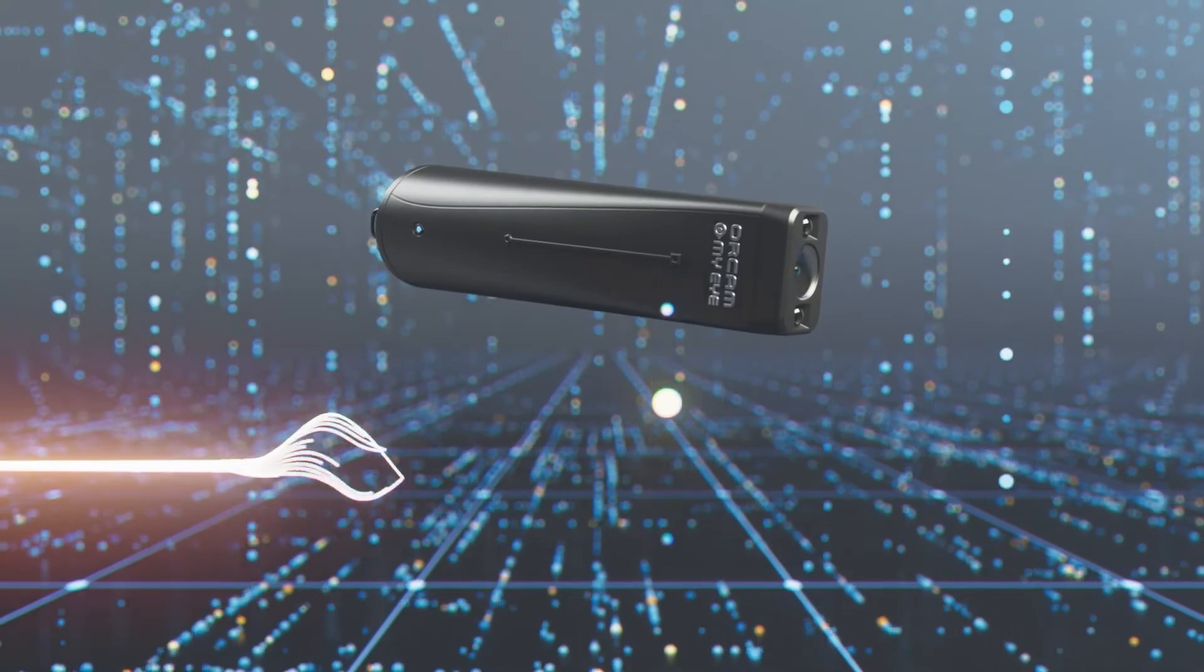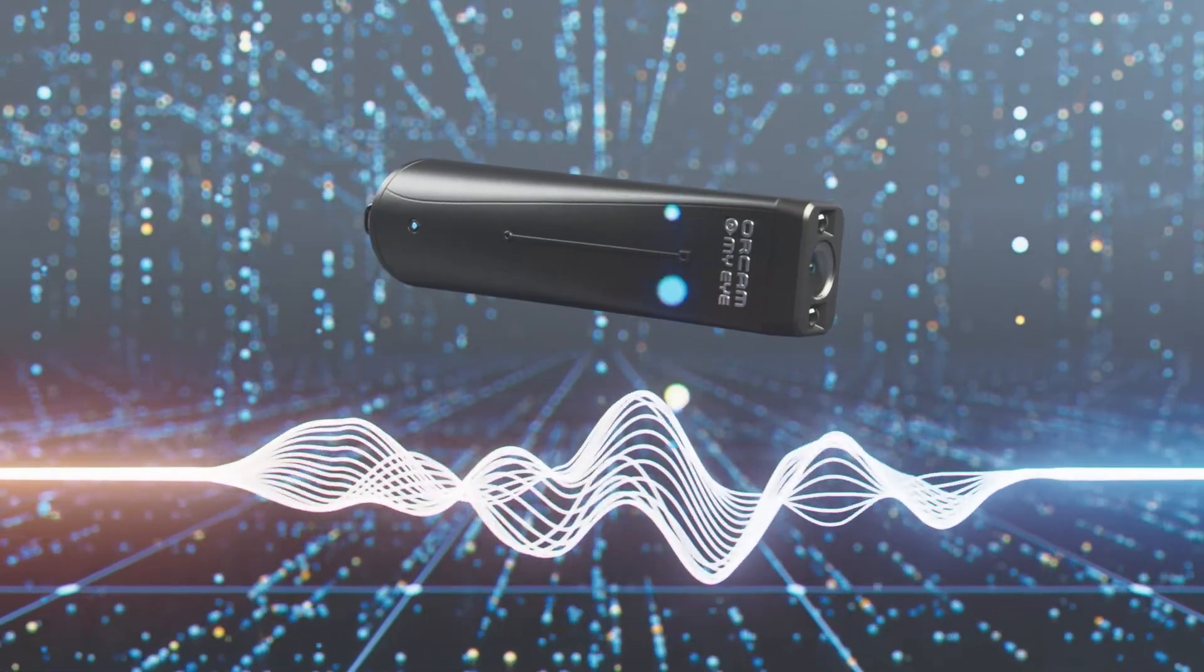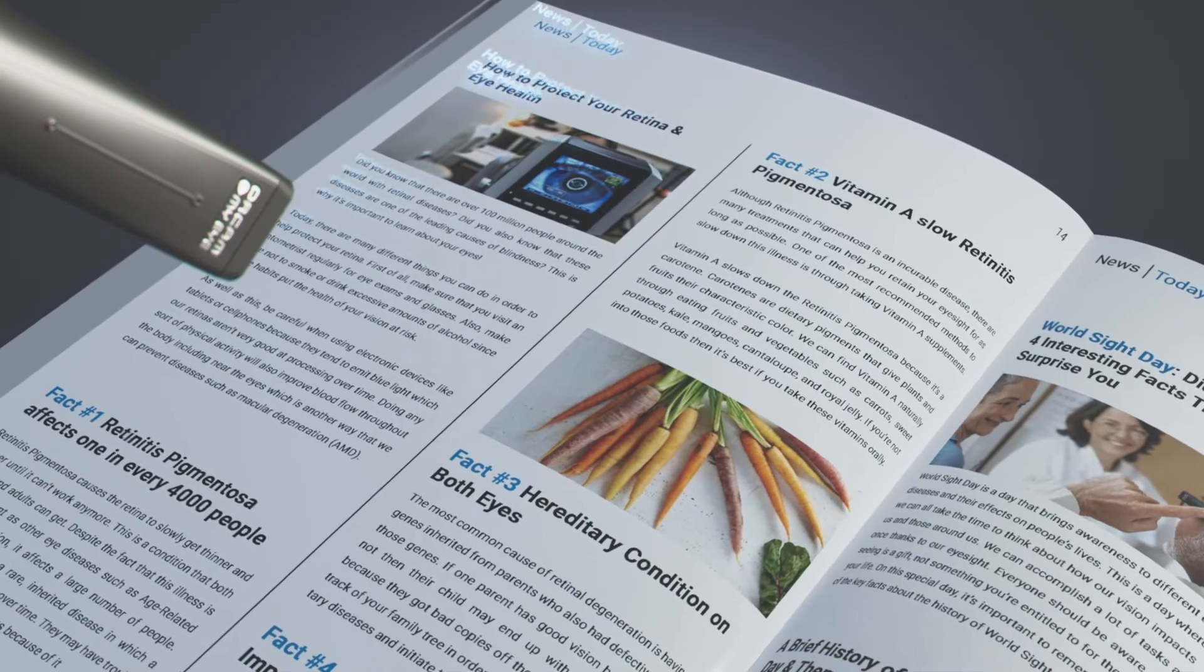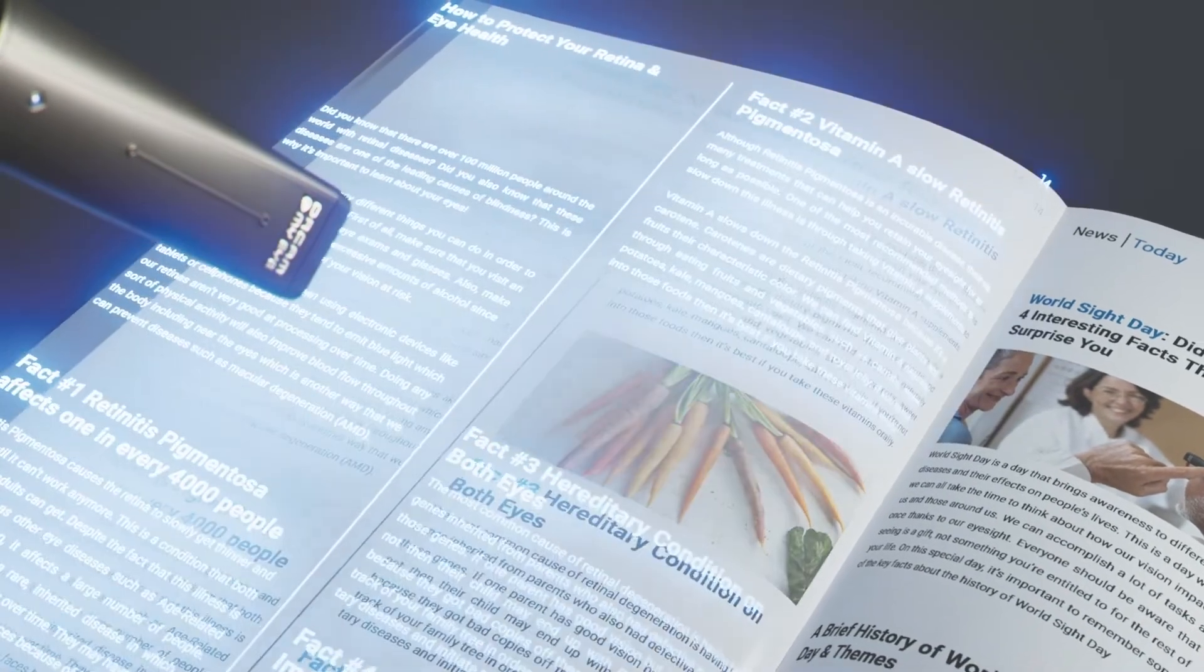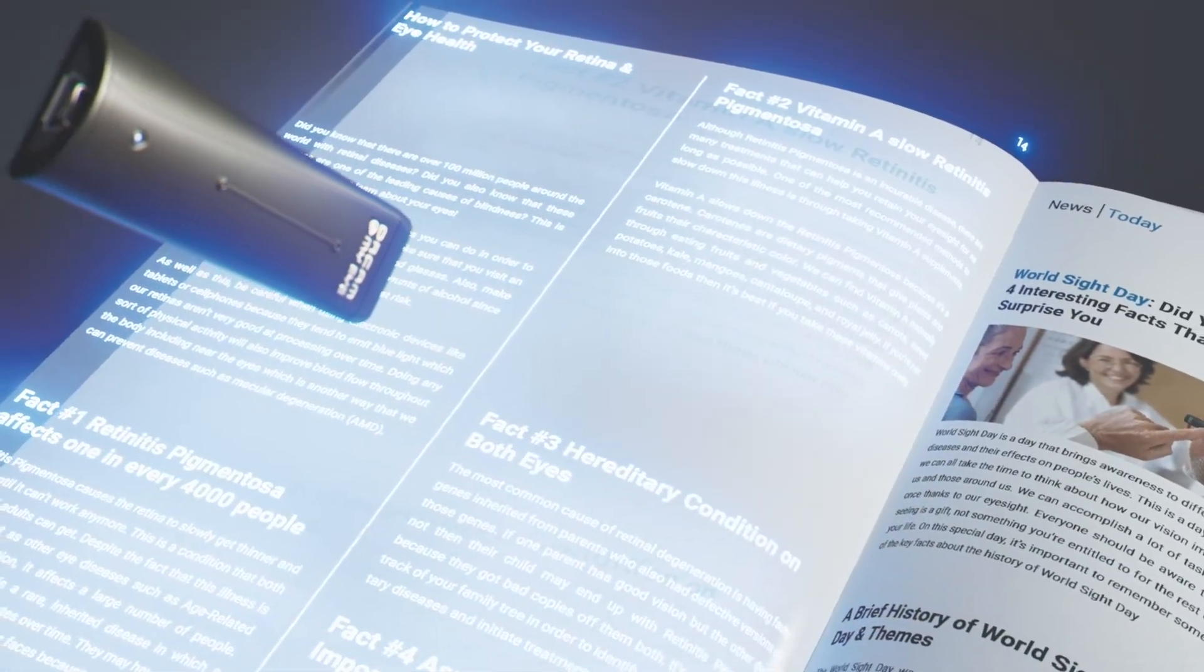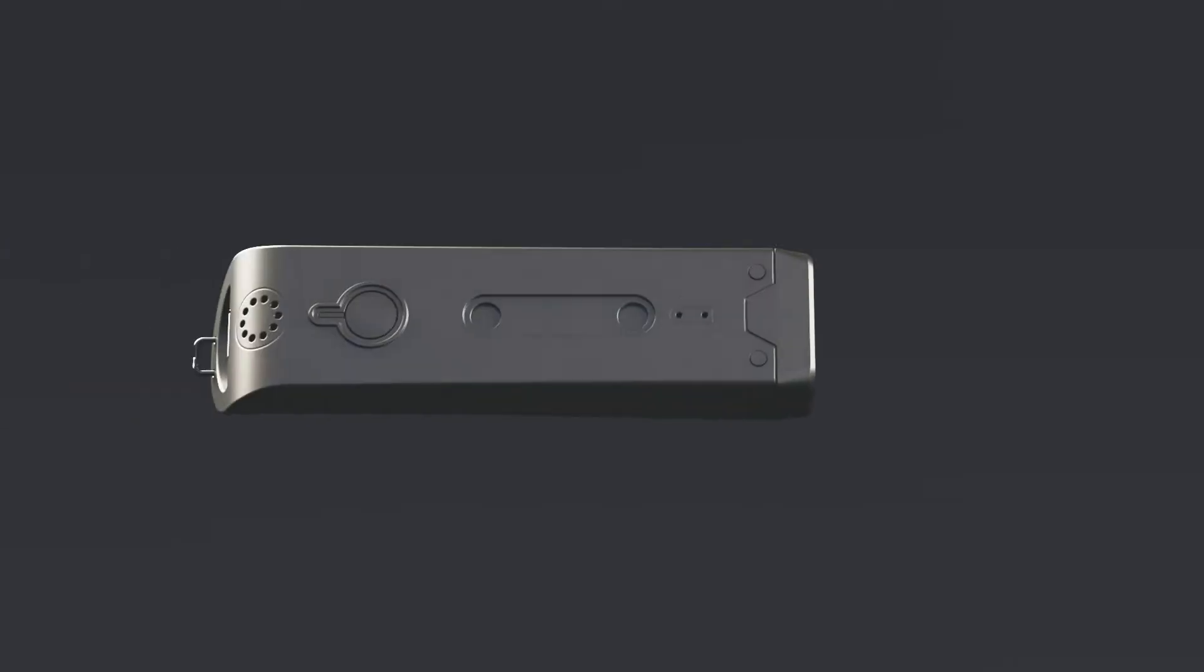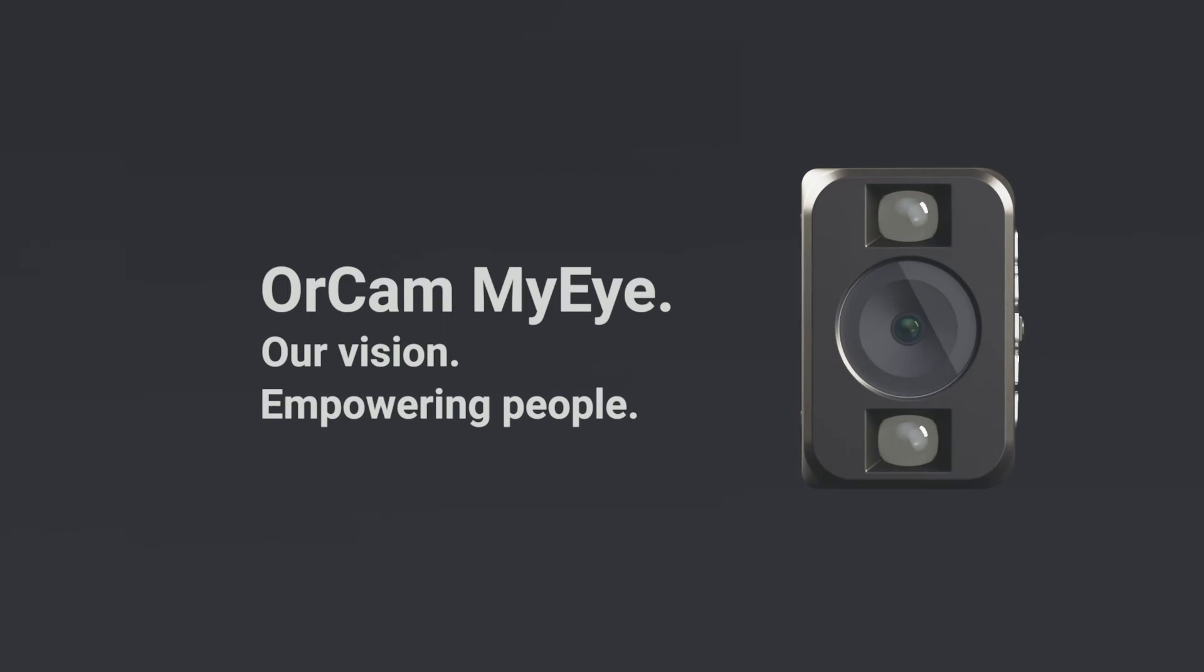Simply use voice commands to control all device features and settings. OrCam MyEye is your trusted companion. Advanced assistive technology that empowers you everywhere you go. OrCam MyEye, our vision, empowering people.